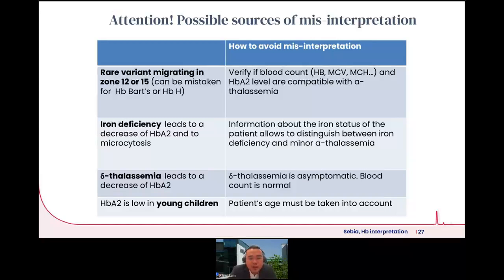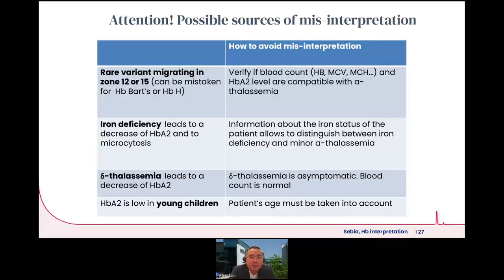It is important to be aware of possible sources of misinterpretation. In the zones where you see hemoglobin Barts or hemoglobin H, a rare variant migrating in those zones is possible. Always verify the blood count and check whether the A2 levels are compatible with alpha thalassemia. Iron deficiency can also lead to a decrease of hemoglobin A2 and microcytosis — always rule out iron status influences before concluding thalassemia. Delta thalassemia can similarly decrease hemoglobin A2.